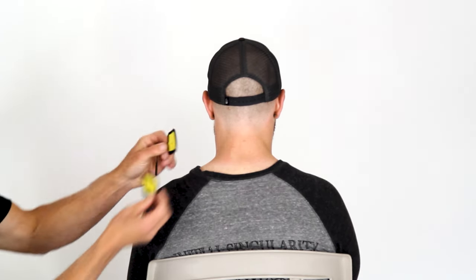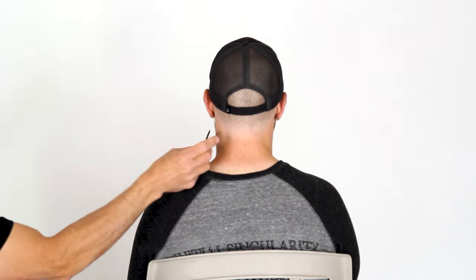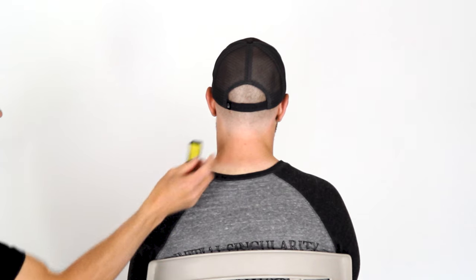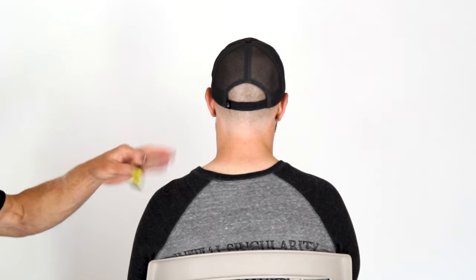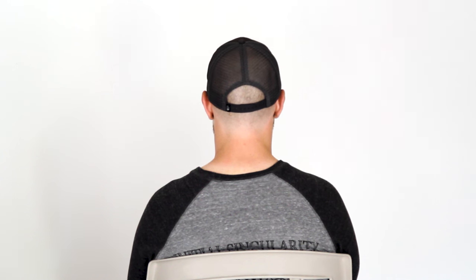We're not going to go below the ear — that's near the carotid sinus, so we need to stay away from that. TENS units are also not recommended for headaches, so you're not supposed to put them on your head.